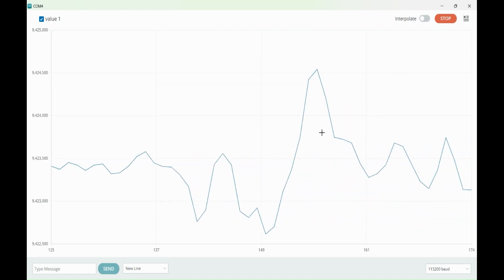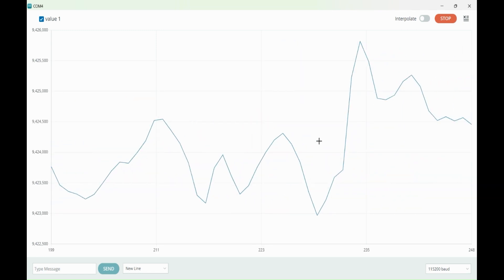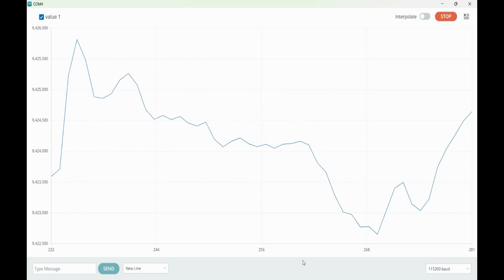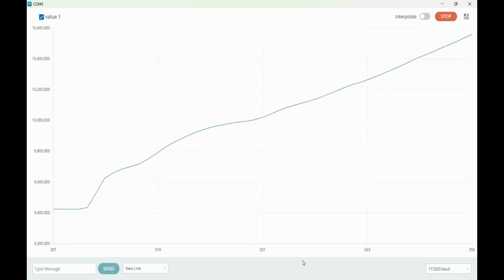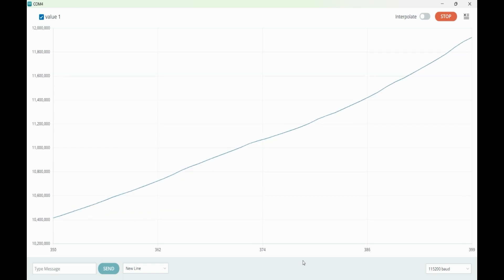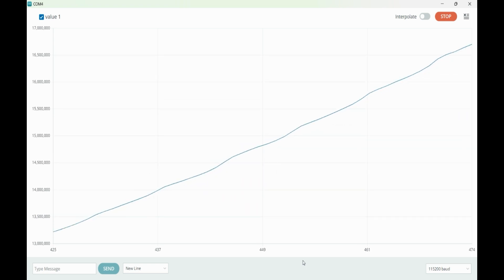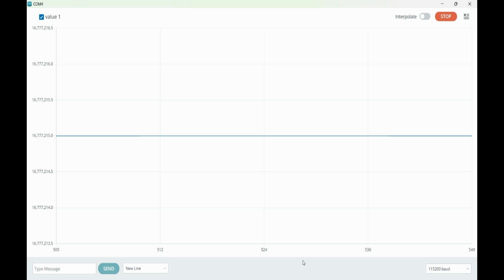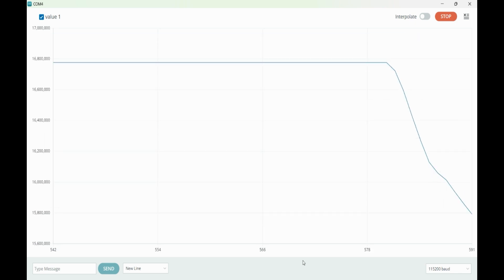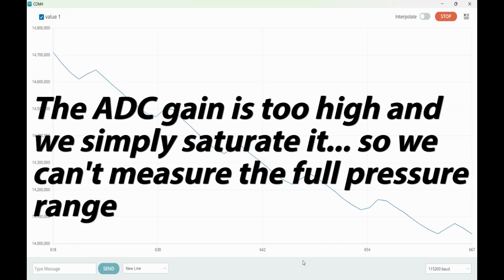What we have here is the streaming output from the ESP32 board collecting data from that pressure sensor. At some point I start pressurizing the cuff and you can see the pressure is increasing. Unfortunately, this sensor's A-to-D converter kind of maxes out — it reaches a threshold, so the range isn't really appropriate for the task. Now we release the pressure and the cuff is deflating, and what you can see here are the pulses.